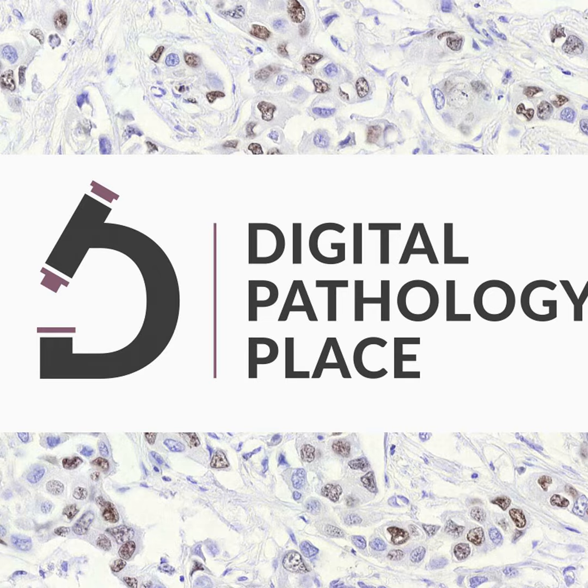And actually, I believe it's 2016, the FDA put out a guidance document that told the world, at least in the United States, how it wanted to look at these systems. And as you mentioned, we had a great year last year, two 510Ks. In the summer, we had our first clearance, which includes a couple of performance studies, which I'll go into. And then we had a second one, called a special 510K. That is for occurrences where you're basically adding components, but you're not changing the intended use, and you're not really making major changes to it.